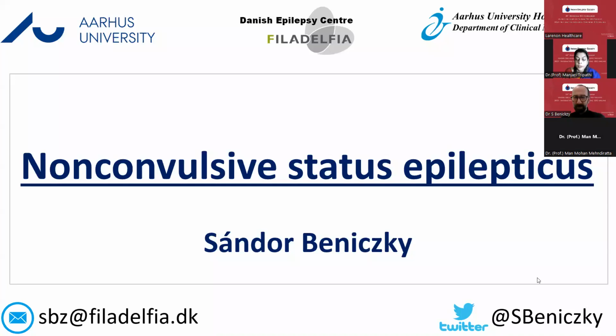So the high density EEG, which systems are you using? We use EGI, the same that you have. Yeah, we have EGI too. We do high density only for very complex patients where we are not able to clear them straight away. Anything not cleared in the first epilepsy meeting on the patient, we send for both EGI as well as MEG. That's what we used to do many years ago, but then we realized we would save resources if we start with high density EEG. It's also less resource demanding, and then if that's uninformative, we send to MEG.